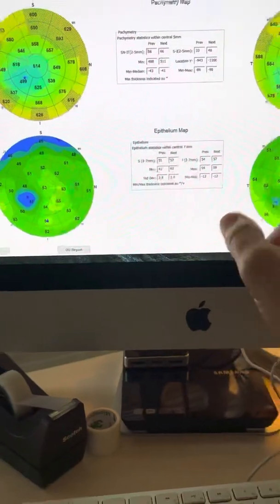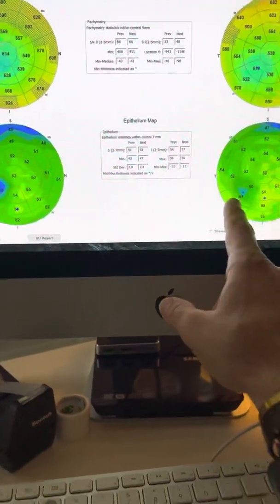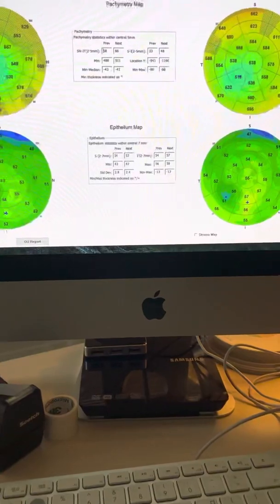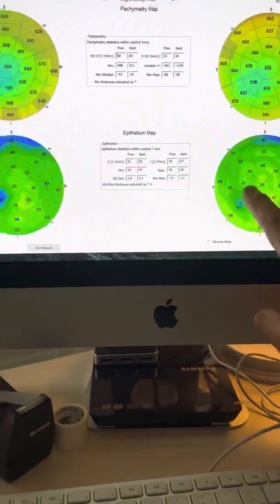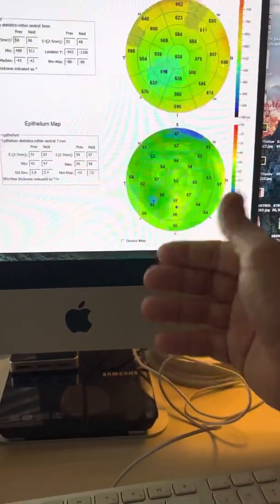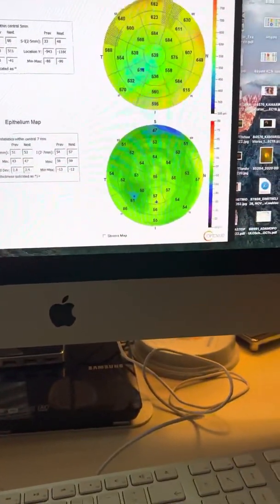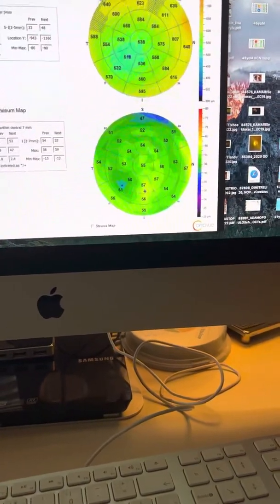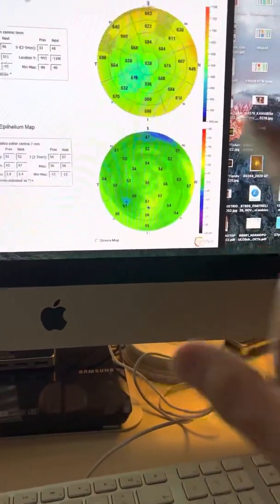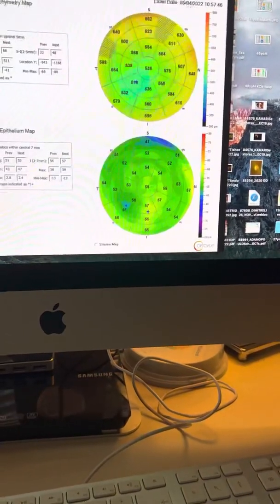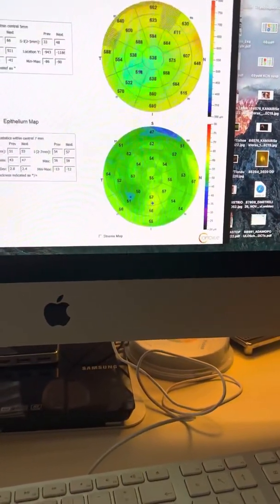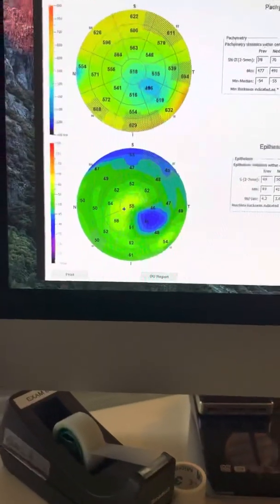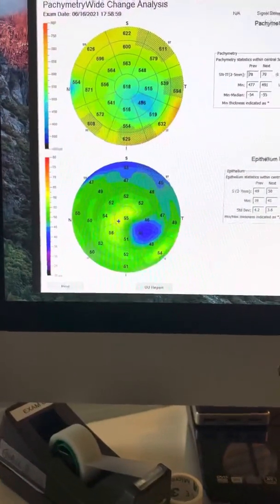So we're ignoring the slight increase in topography, which is normal because as the epithelium has thickened over the cone area, it's normal for the topographies to become a little bit steeper. But in essence, we have proof here that this cornea is more stable. Very, very important point. We've tried to underline it in the most recent ASCRS meeting in Washington, DC.